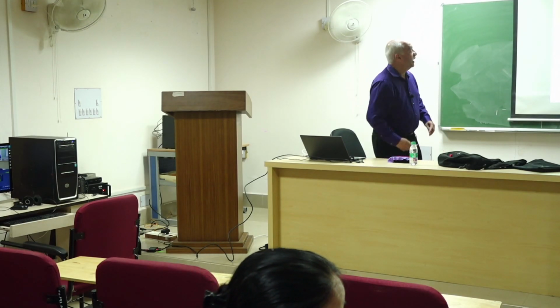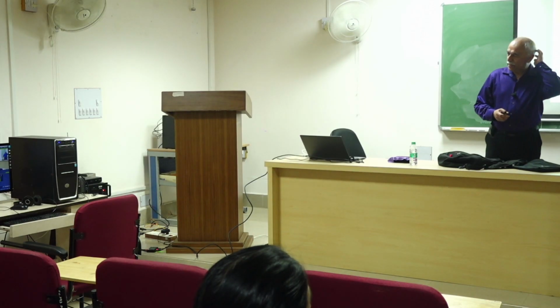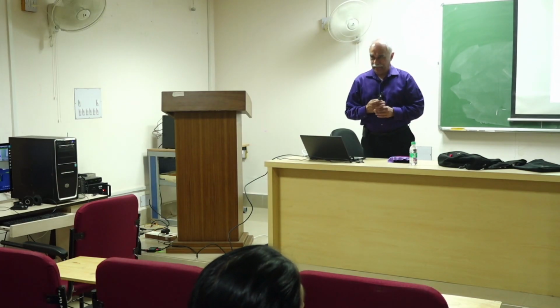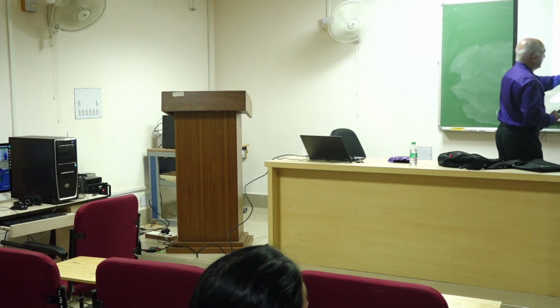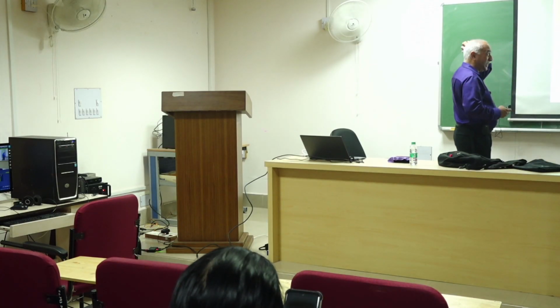Okay. So let's take up our next topic, which is image processing for analysis and classification of benign and malignant vertebral compression fractures using MRI. So this was a project of Dr. Marcelo Henrique Nogueira Barbosa in Brazil and his collaborator Paulo Mazzoncini de Azevedo Marques.